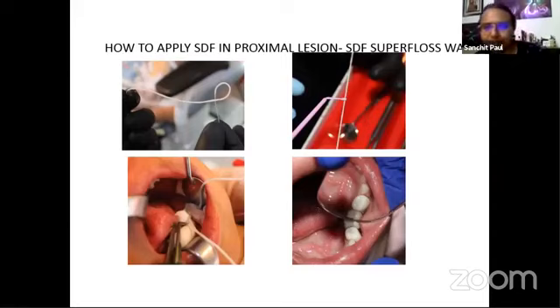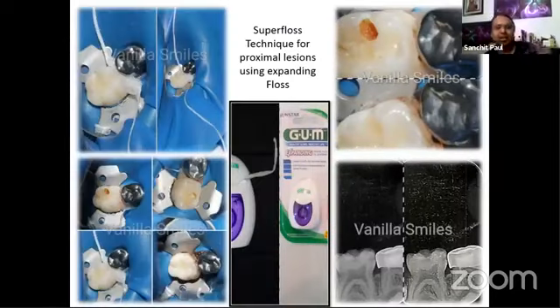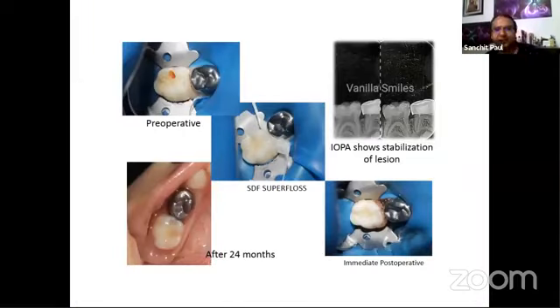Now, SDF can be used also in proximal lesions, in what we call the expanding floss way or super floss way. And as we mentioned, just because you can place a rubber dam and you can place a crown, it doesn't mean that we really need to go and do all those tricky class 2s. As you can see in the radiograph, there is a lesion inside the dentine in the outer half, completely approaching the enamel. Once you put SDF, that lesion was stable for more than a year, and now it is still under follow-up. Although there's a slight discoloration, it's between the 2 teeth, which is hardly visible. So these are again minimally invasive pediatric dentistry ways where we don't have to do too much to manage things.